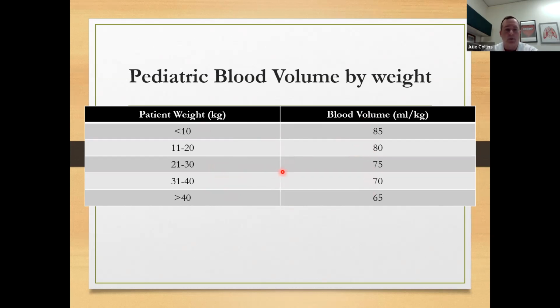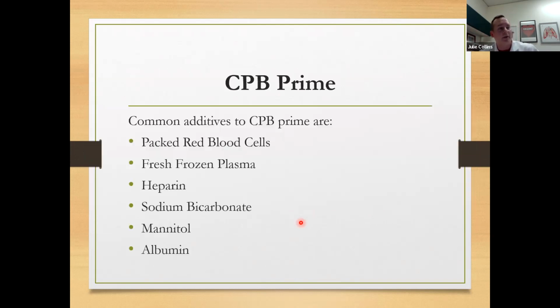Not perfect because we don't always know how much they diurese. We don't know how much volume anesthesia has given. So there's a lot of factors to control there, but this is about standard in terms of what's accepted. Might be on your boards. I haven't taken the boards in 25 years, so who knows?